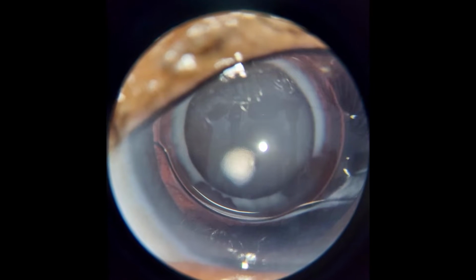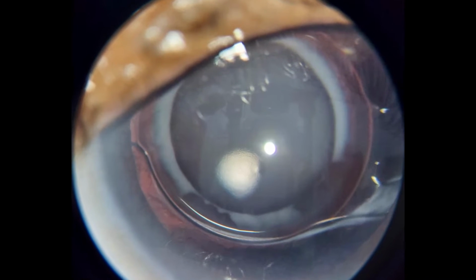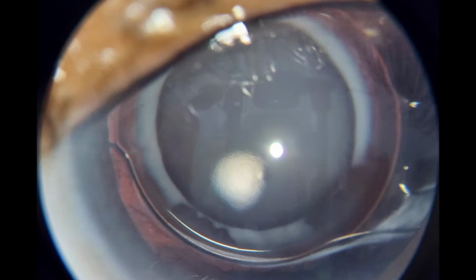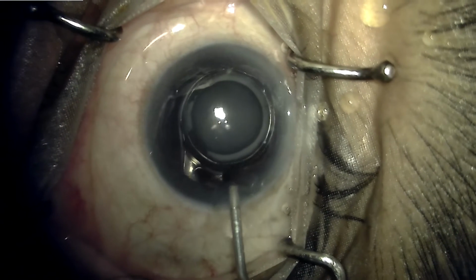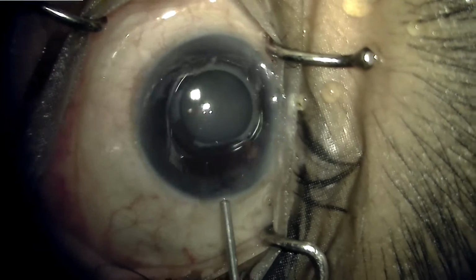Now we had this patient who was operated 2 years back with a significant opacity in the lens, and this was a hydrophilic monofocal lens from one of the companies where it was reported that this has been occurring quite commonly with these lenses. So we planned to remove this IOL and exchange it with a fresh IOL, using intracameral lignocaine.